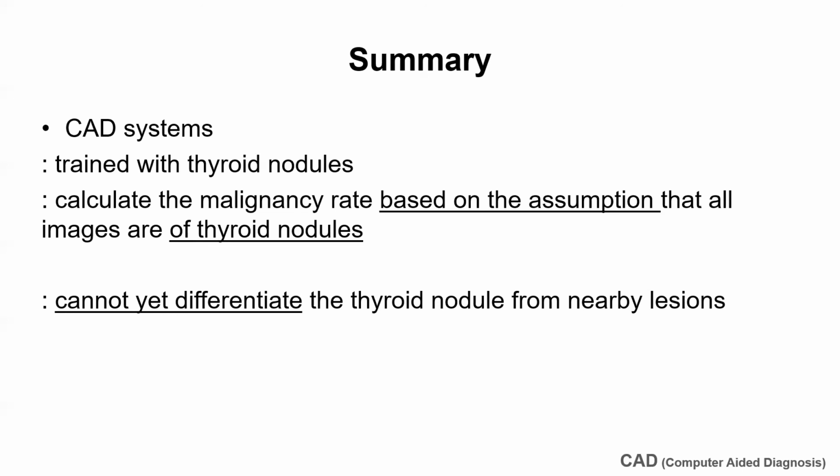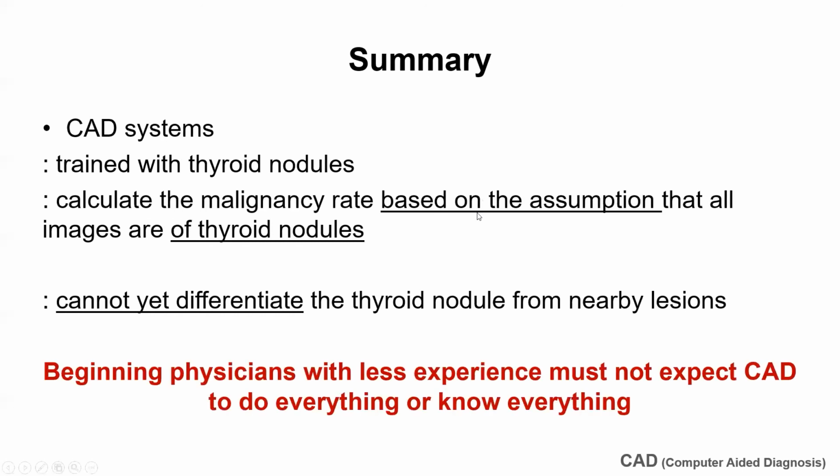From what I have reviewed today, I think you will agree that CAD can benefit beginning readers, but that it cannot yet differentiate the thyroid nodule from nearby lesions. This part of the diagnostic process is still completely dependent on the skills and experience of the performing physician. Therefore, beginning physicians with less experience must not expect CAD to do everything or know everything.